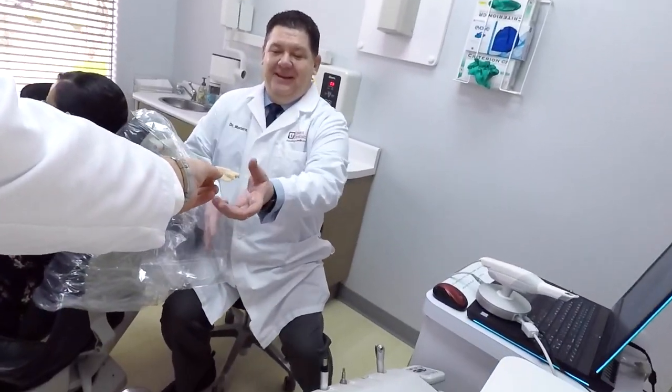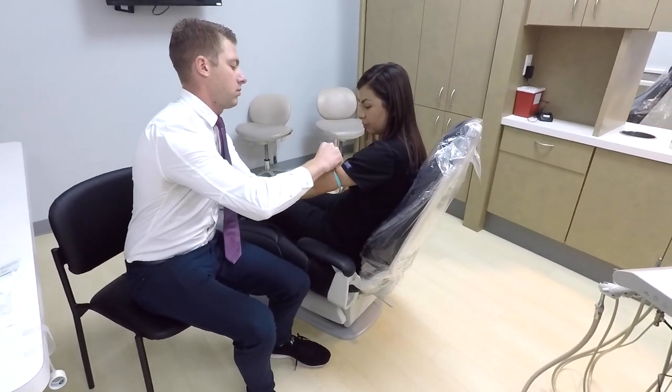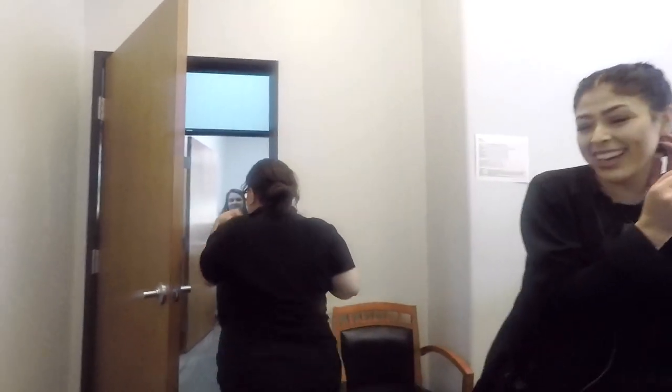We're going to be shooting some B-roll for our website, so come hang out. I used Omni Chroma for two Class 3s to close a black triangle between number 8 and 9 on my boy Victor.